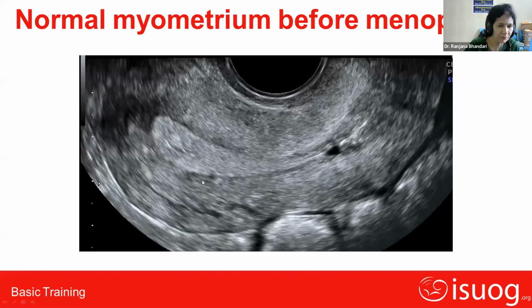Uterus from the middle layer of the uterus. And you have to remember this also, this is the junctional zone. We will see this junctional zone during our adenomyosis session. So now I think you must know this whole is the myometrium.